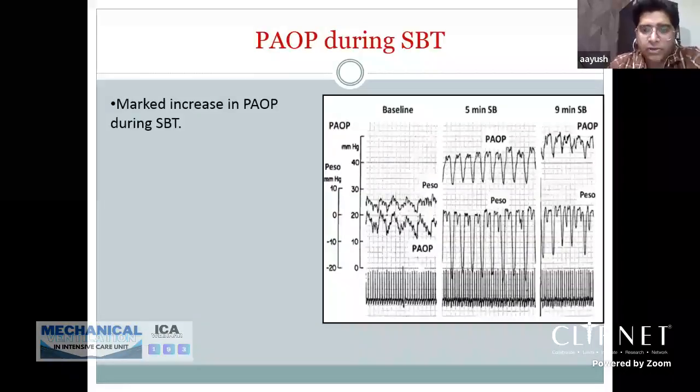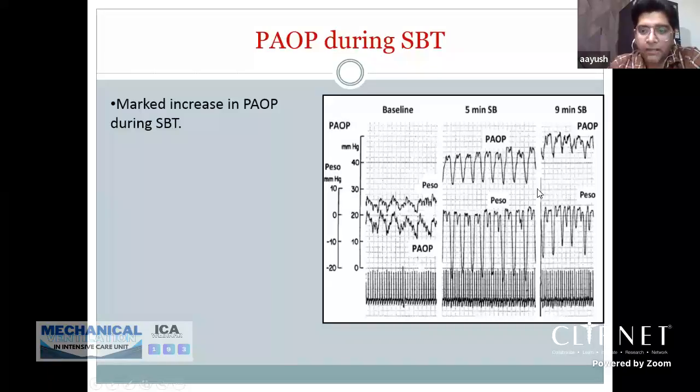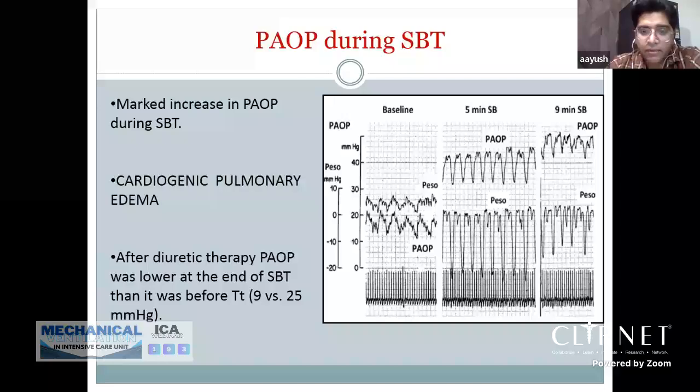What they found was that when this patient was weaned from mechanical ventilation to spontaneous breathing, there was a significant elevation in pulmonary artery occlusion pressure, which was measured with a pulmonary artery catheter in place. Also, at the time of weaning, the esophageal pressure goes down significantly because of negative pressure, but the difference between the pulmonary artery pressure and the pleural pressure outside, that is the esophageal pressure, is still quite high. Hence this significant elevation in pulmonary artery pressure led to the development of cardiogenic pulmonary edema in the process of weaning, that is, negative pressure pulmonary edema. And they found that after using diuretic therapy, these patients showed a significant reduction in pulmonary artery pressure at the end of the SBT and hence successful weaning.